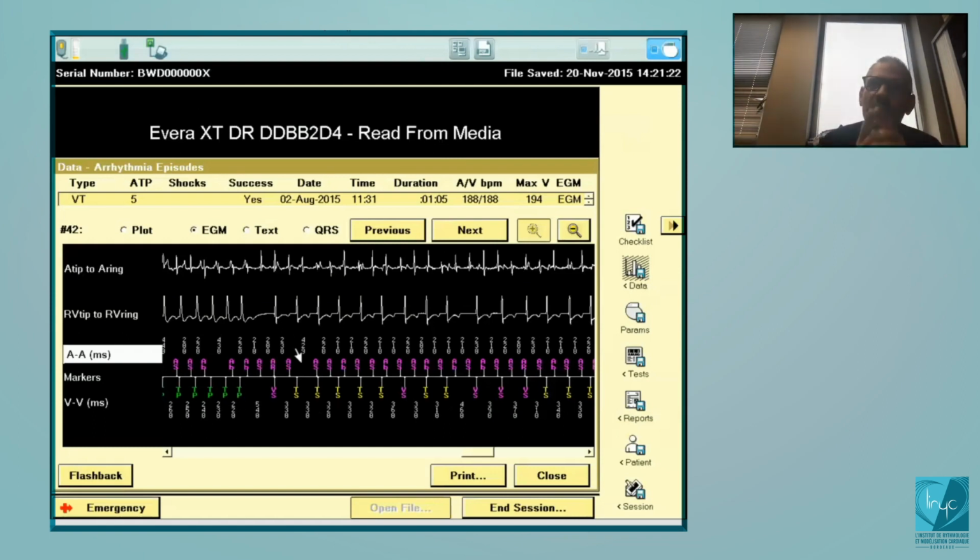In only some situations, when there is a diagnosis of VT and dual tachycardia, then you will have a look at the wavelets. If you want to rely only on the wavelet, then you need to unprogram the PR logic. Okay. So it's important in Medtronic to understand in a dual chamber which are the discriminators and which is the first discriminator to be analyzed. If you program stability and sudden onset, it will be analyzed before the PR logic. If you program them off, then you will start with the PR logic. And if the PR logic says this is a VT because ventricular rate faster than atrial rate, no analysis of the morphology. Okay, so that's, I think, something very important.